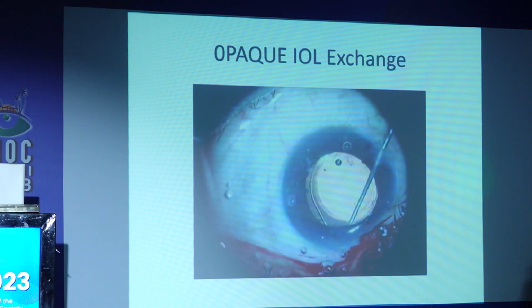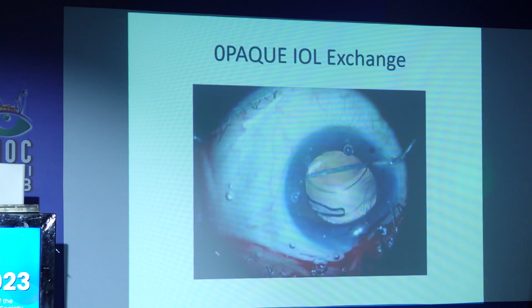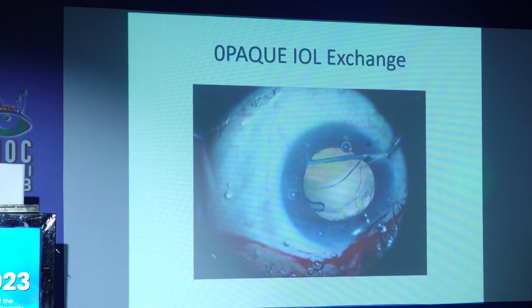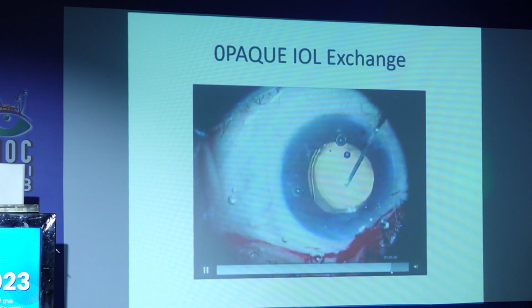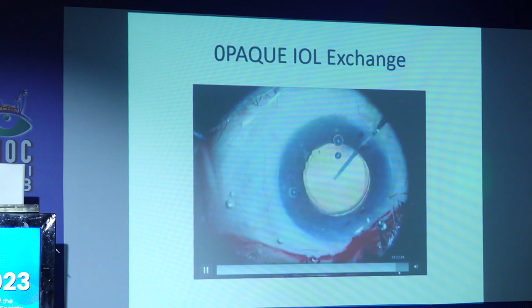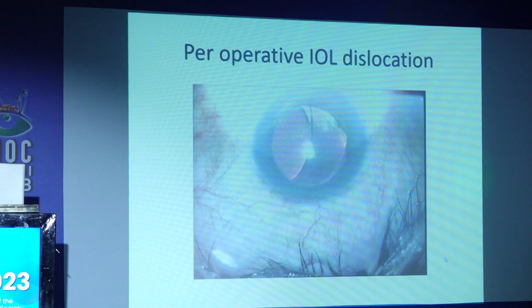So sometimes these lenses, I have used many opaque lenses. Sometimes even if haptics are stuck, you just cut the haptic, remove the optics, then you can still use the bag. Pulling out those stuck haptics, you will remove the total bag, so no bag is left post-op.